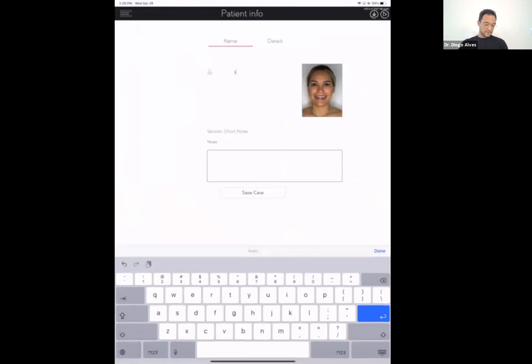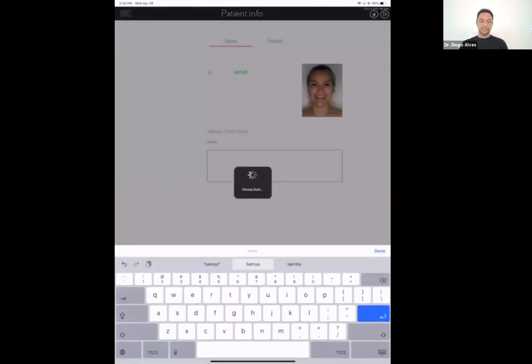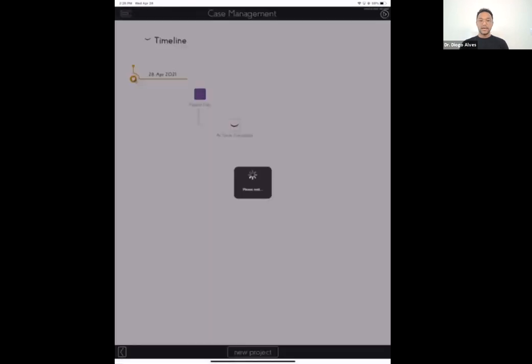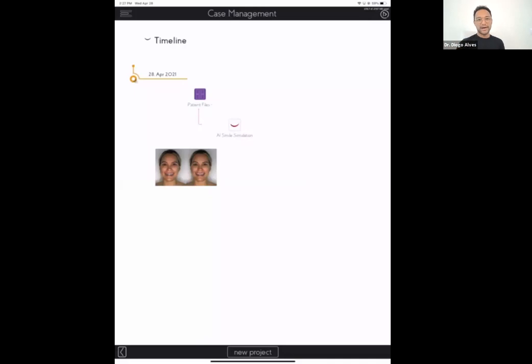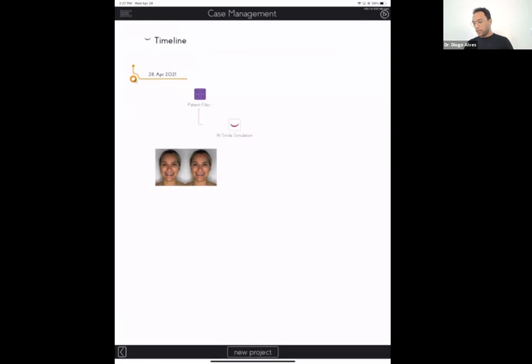Tap Next and you have your initial smile design. You can show the patient a before-and-after picture by tapping Before and After at the bottom — you automatically get a before-and-after image to send to your patient, to your lab, or to other doctors involved in the process. This is the first step to engage your patient, understand their desires, and proceed with the treatment plan. Save the case, and now you have all this information on your iPad, iPhone, or MacBook.